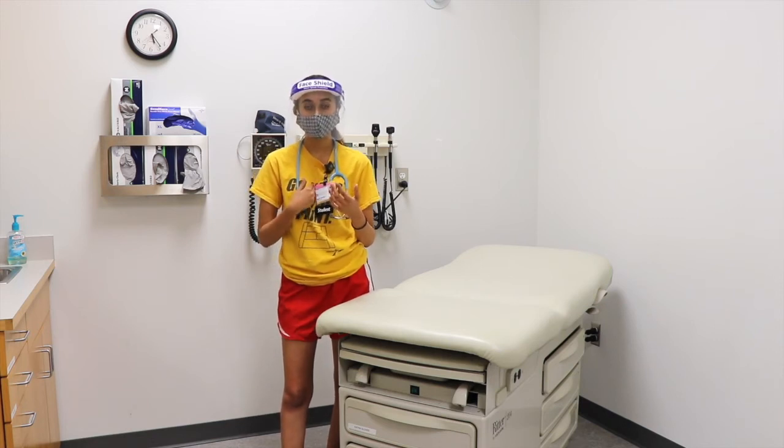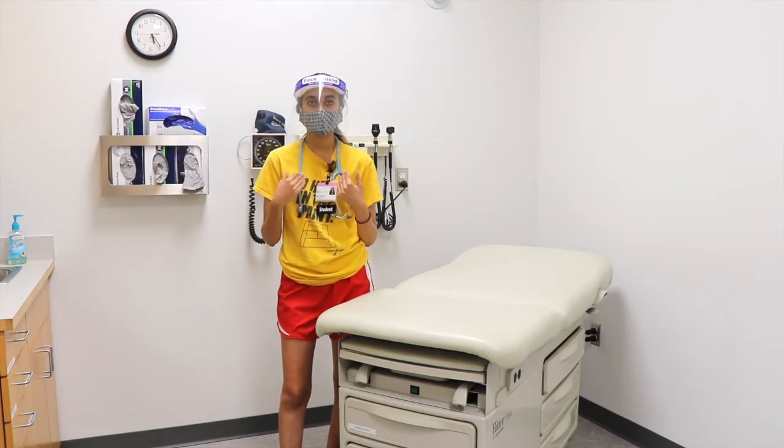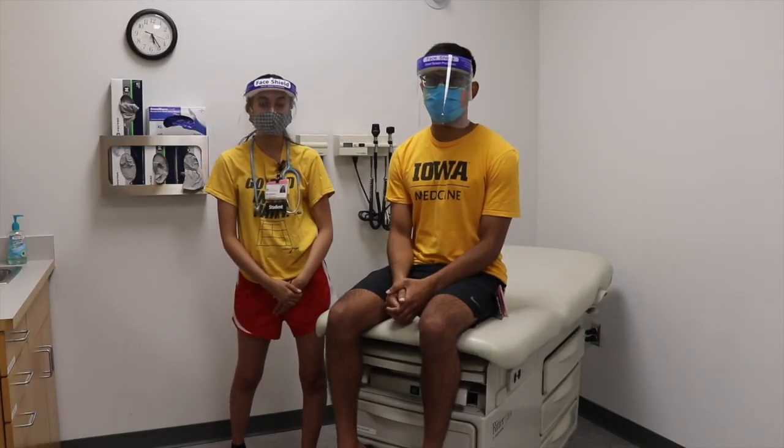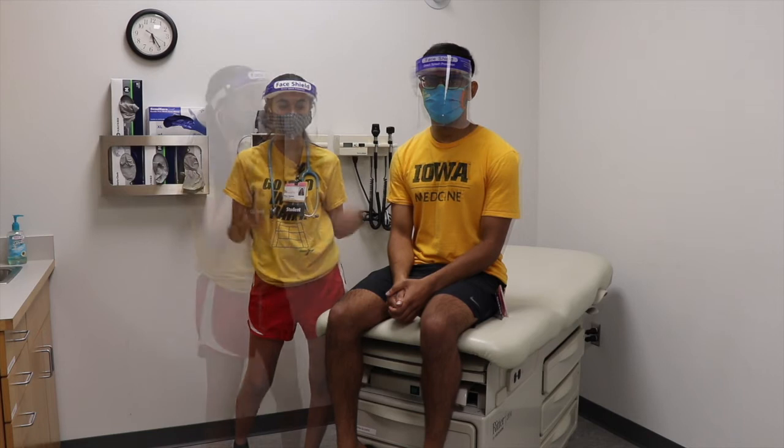A septum is the wall that splits your heart into left and right. We also use this to gauge if your valves are working properly. We have valves between our atrium and our ventricle, and also our ventricles to the greater vessels. And so we use this, and we listen to 4 different places in your chest to hear if your valves are working properly. And so now I'm going to show you guys how to auscultate the 4 different valves.